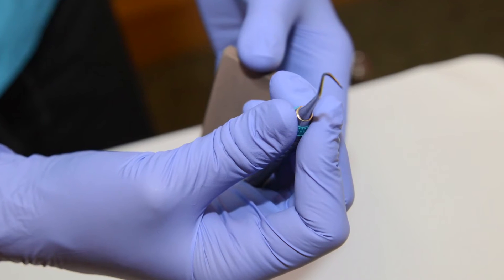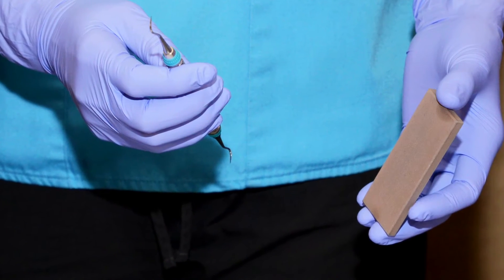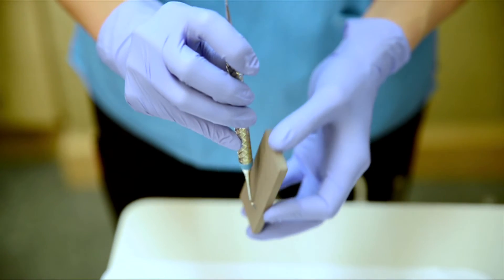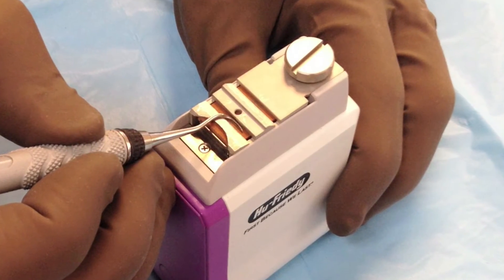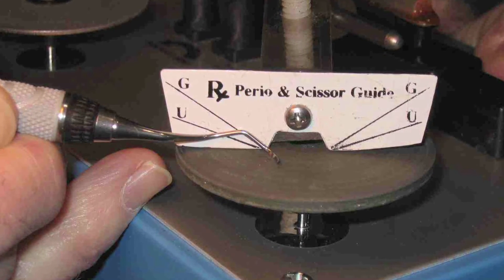Another important way to reduce pinch force is to keep instruments sharp by replacing the tips and sharpening them regularly. There are several ways to sharpen instrument tips: use a stone, an electric sharpener, or a sharpening wheel. Tips should be sharpened at least once a day. I noticed that when I was having discomfort, sharpening my instruments more frequently reduced my pain — the instrument was doing all the work.